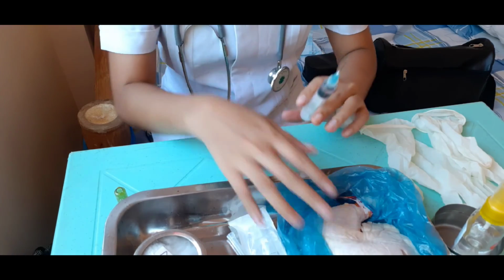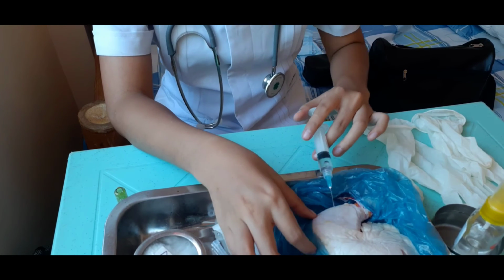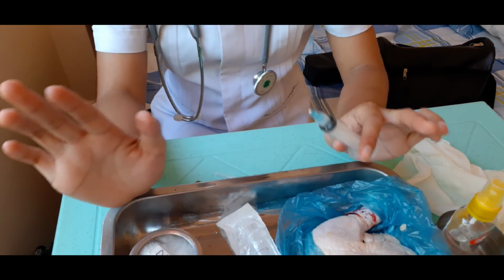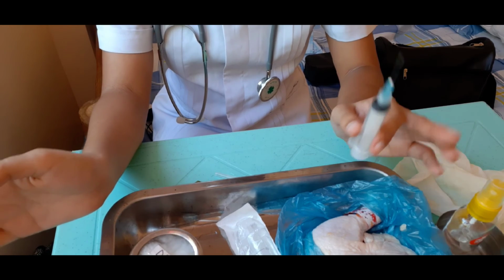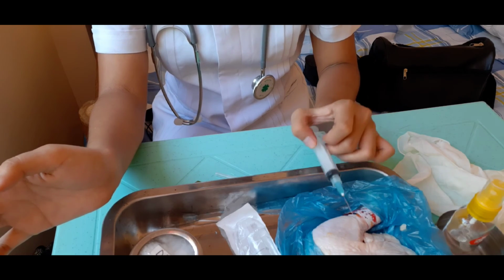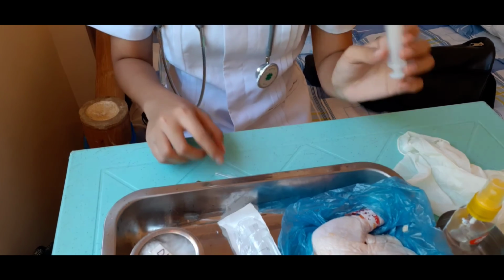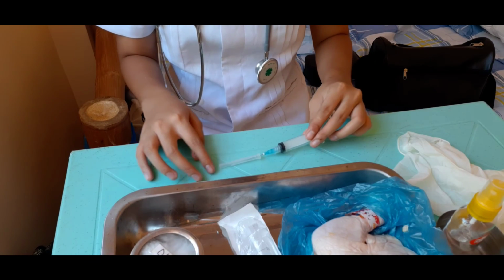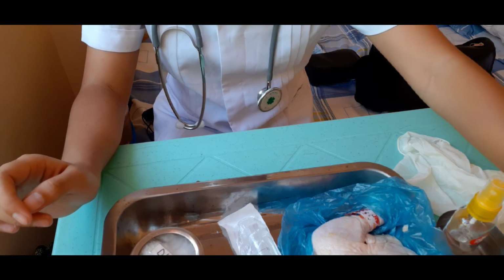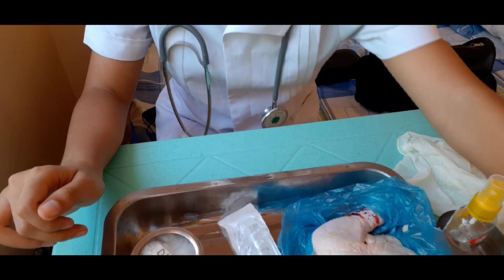Then that is the time that we are now going to insert the needle into the skin of our chicken. So alright, I am done. For example, I'm just assuming that I am done injecting, or inserting the needle, to our patient, which here is the chicken. So now I'm going to place the cap of the needle and put it in a sharp container. Then next, the body of the ampule is also put in the sharp container.